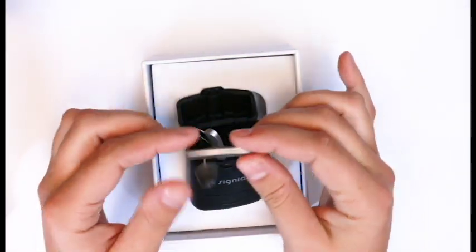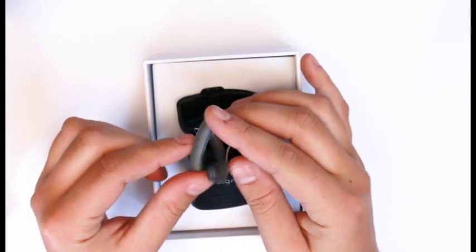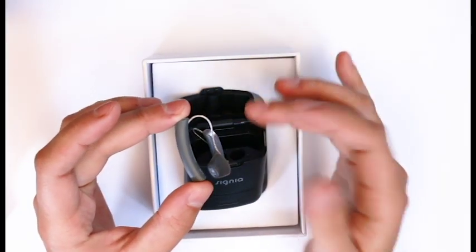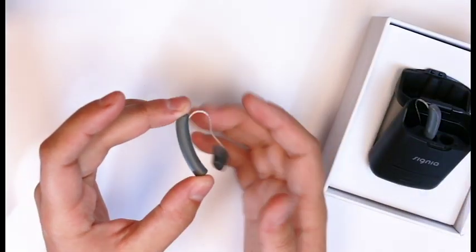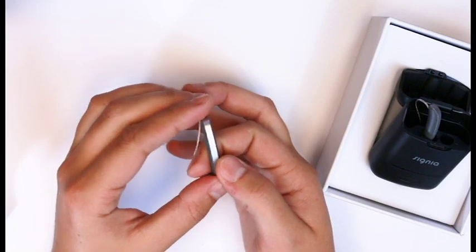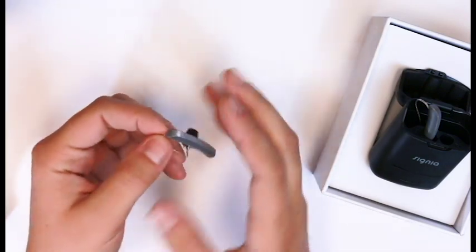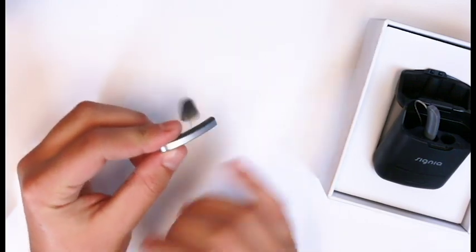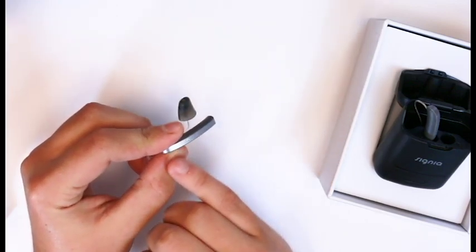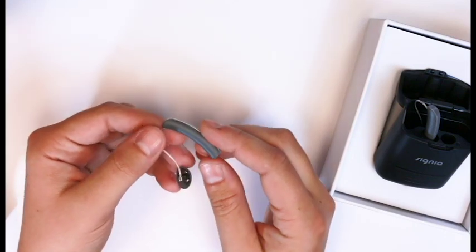So this is our Styletto — as you can see, it's definitely a lot different than our current hearing aids. It's a little bit longer but a lot thinner side to side and thinner from the back. They've gone with this contemporary design — there's no pins, there's no battery doors. We've added this nice brushed chrome or silver finish.